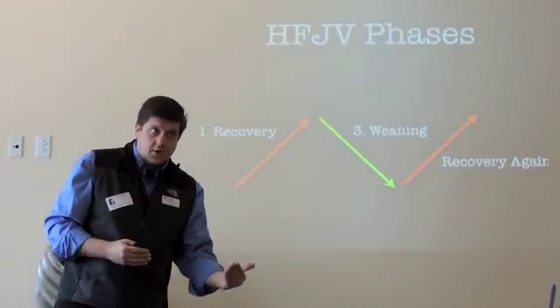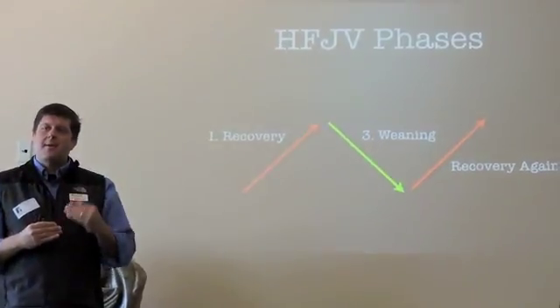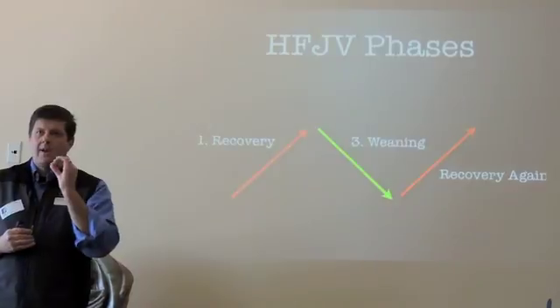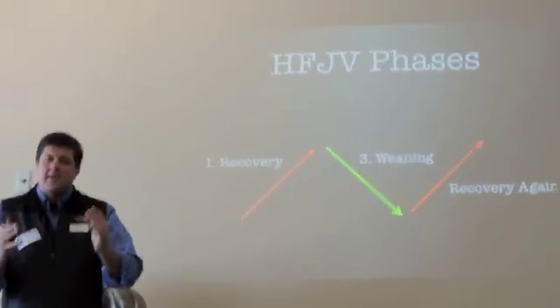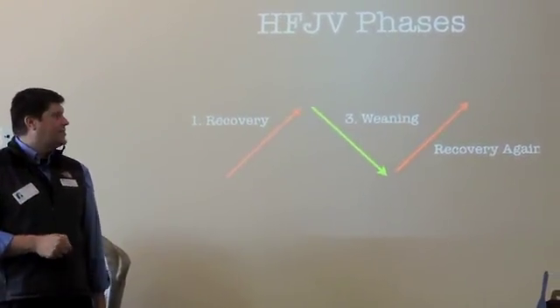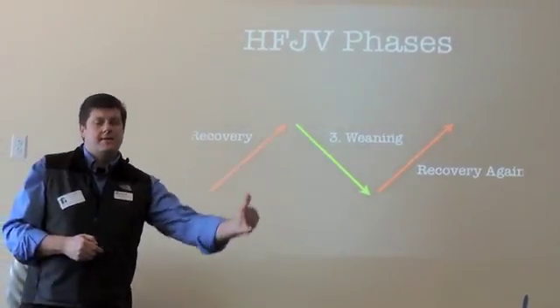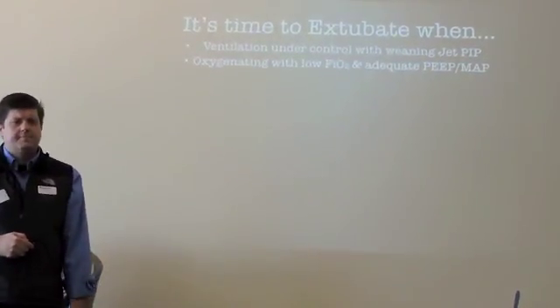Then we can start weaning. But that's that stabilization phase that I was talking about. When you finally hit that right delta P, when you finally hit that right jet rate, everything syncs together. Chill out in the stabilization phase and don't be so aggressive with weaning, because it leads to recovery again, and it leads to longer stints of them being intubated and on the ventilator.